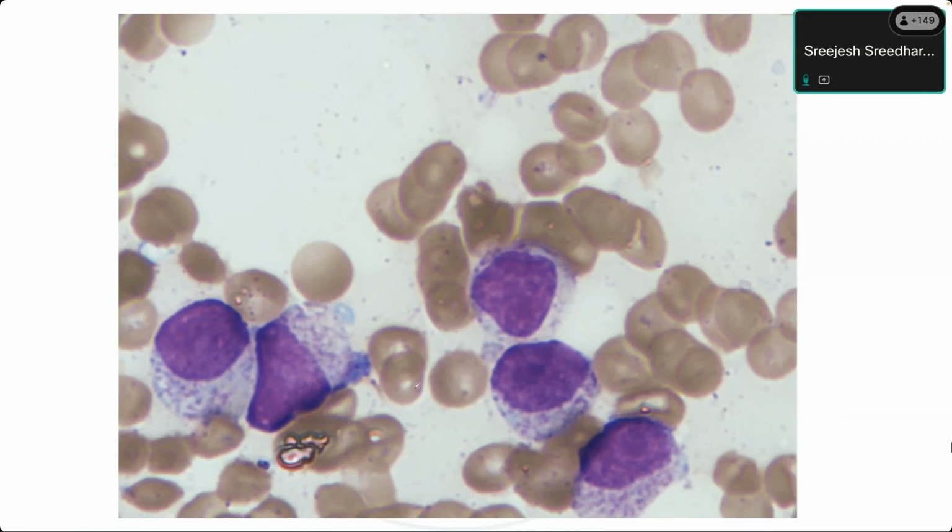Any other differential? Suppose a patient is sick, with fever. A leukemoid reaction. You can't say leukemoid reaction if you have seen only these kind of cells, and suppose this is a bone marrow. Before calling leukemia, what will you think of? Do you think of maturation arrest? So these are reactive situations because of sepsis or some drugs or some infection or inflammatory condition.